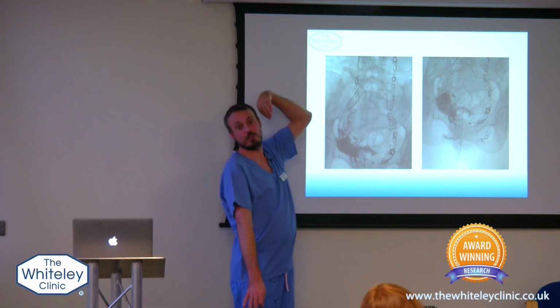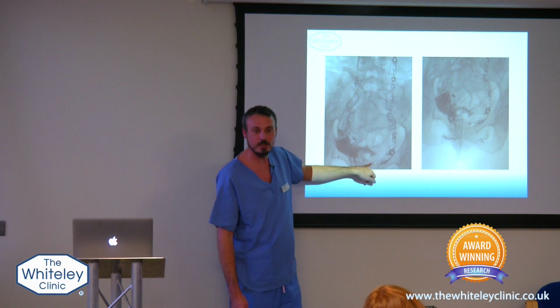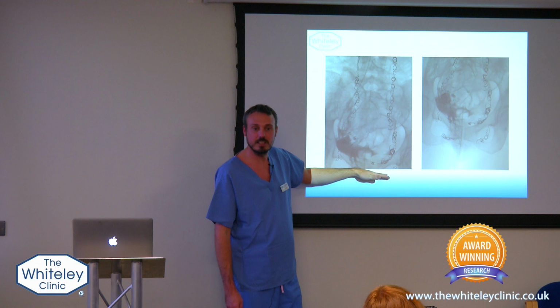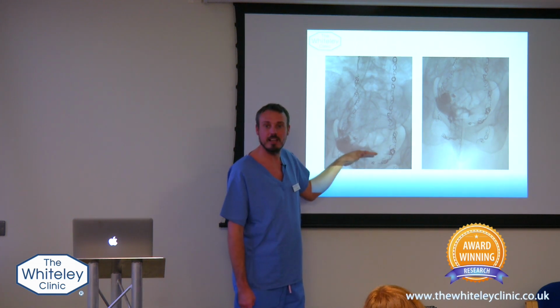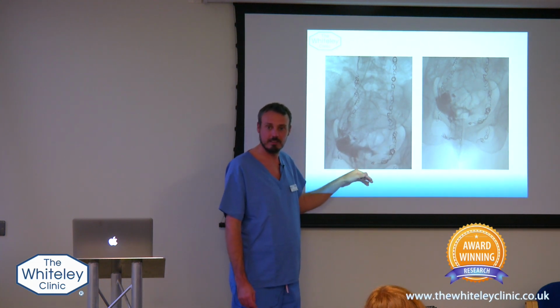Through the long tube, so that the foam sclerotherapy won't come out up here. Obviously, it'll come out where the end of the tube is, which is down here. And if you then Valsalva, it pushes it into the vulval veins as well. So you're going to get much better embolization with the STS and the coils together.